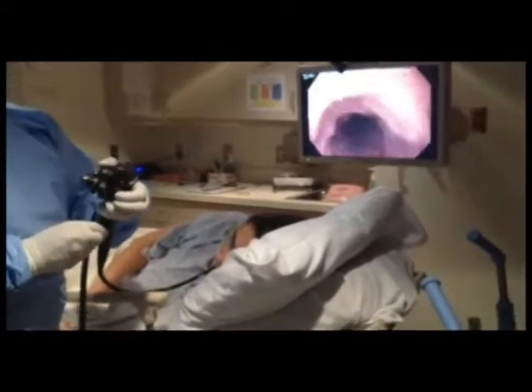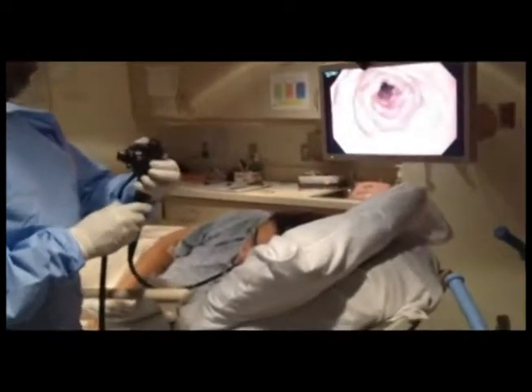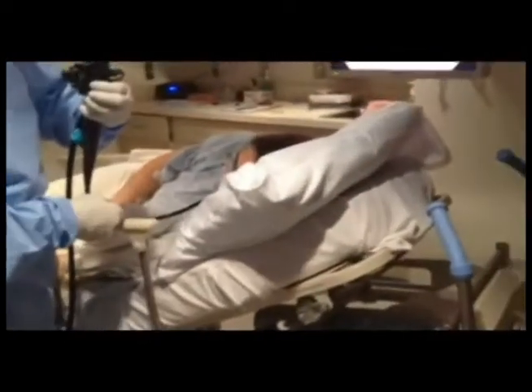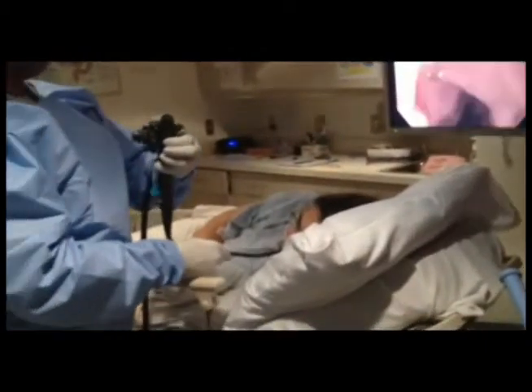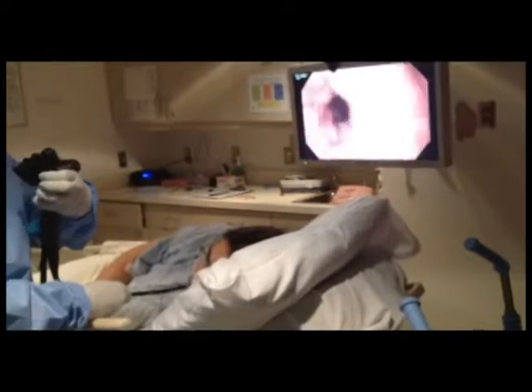The patient is using the left lateral decubitus position. I usually lower the feet because that allows fluid to accumulate in the duodenum. The inner part of the duodenum is retroperitoneal, so when you lower their feet and turn a little bit on their back, the fluid tends to accumulate. As you can see on the screen, there's a lot of fluid here and we're slowly aspirating this.